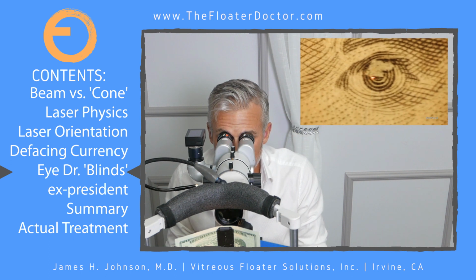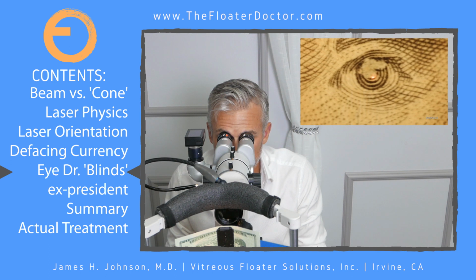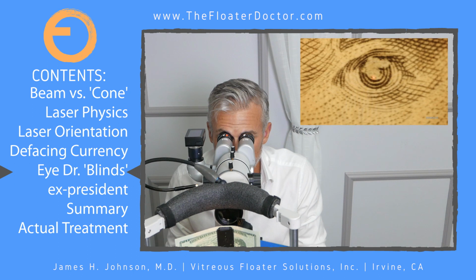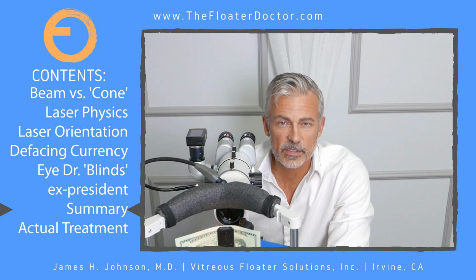So this is just a demonstration of how it's a relatively low energy. It is removing that ink, and that is how the focusing mechanism works. I would not do this to a real person, just the floaters. There we go. I guess you could watch this all day long. I could do this all day long. It's lots of fun. So that's it. That is how the laser works.